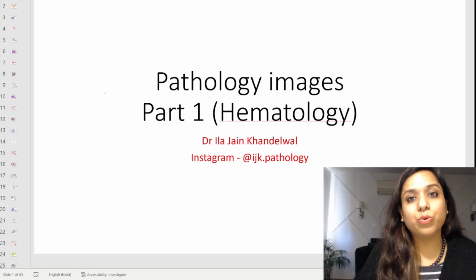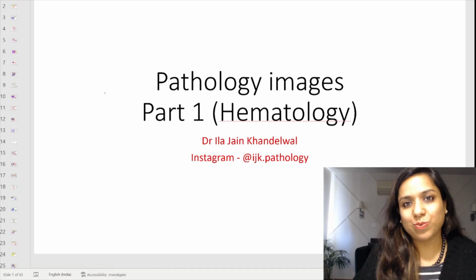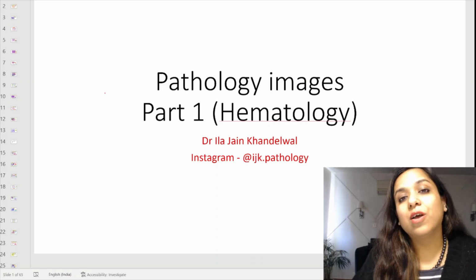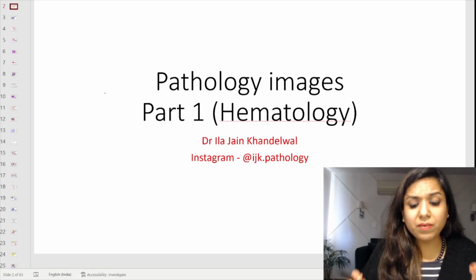So my request to all of you is that if you want crisp and thorough revision of the important hematology images, please go through these videos, right? So let us start the important hematology images from WBCs for FMG or NEET exams, right? So let us move to the first image, students.